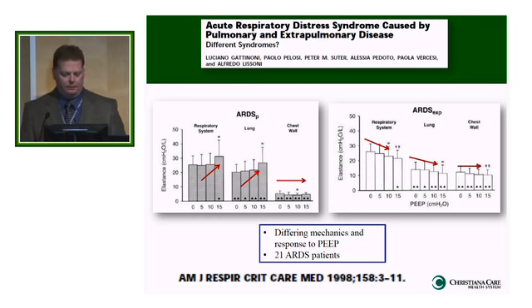And as they applied PEEP, they went from 0 up to 15 of PEEP. You see my arrows here. So the respiratory system elastance is sort of the opposite of the compliance. High elastance is bad because it means your lungs are stiff. What they found is these patients got stiffer as you added PEEP. Their respiratory system got stiffer, and the chest wall stayed the same. There's no difference in chest wall.